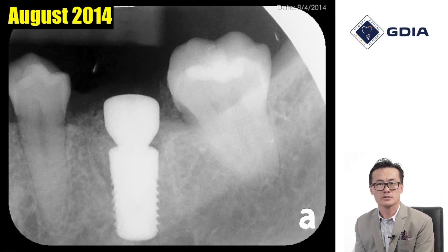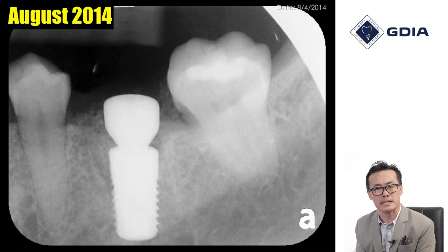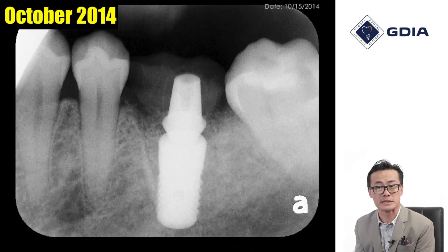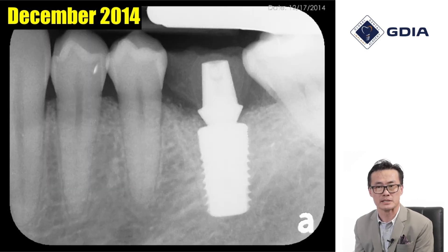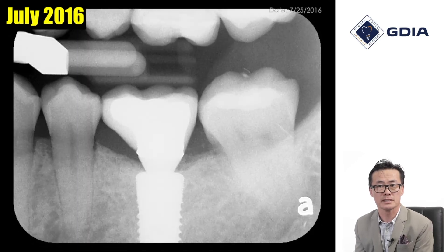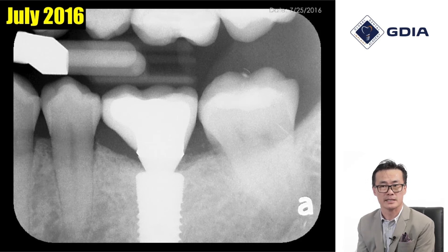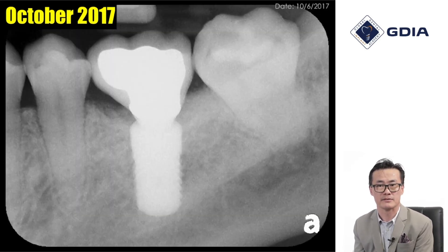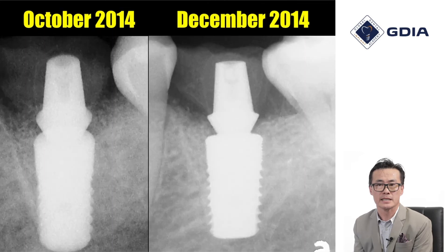Let's review what the periapical radiographs look like. This was immediately after implant placement, this is immediately after the provisionalization stage several months later, we let tissue mature for a few months, then the definitive restoration was delivered and cemented in this radiograph, and then further follow-up is being done.